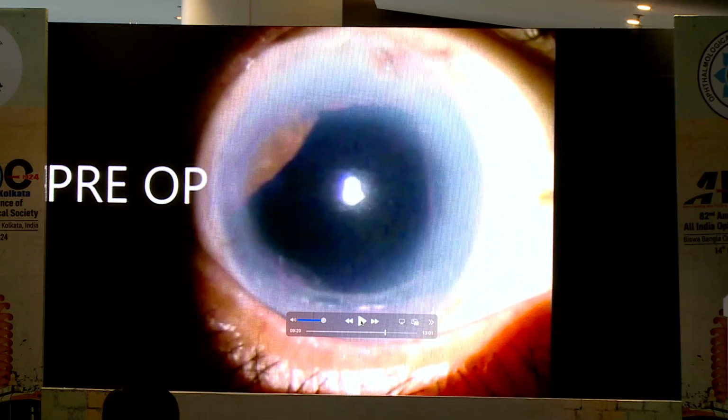This is another case, and a very difficult case. Earlier, when the person was referred to me, I thought this was only a remnant part of the iris. What to do? Earlier, I decided to do a scleral fixated lens in this case, and then I started the surgery. Then I changed my idea. You can watch what to do in this case.